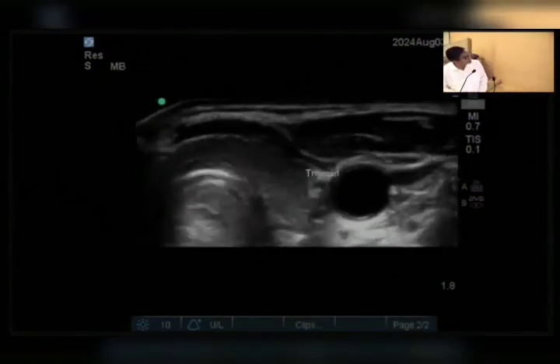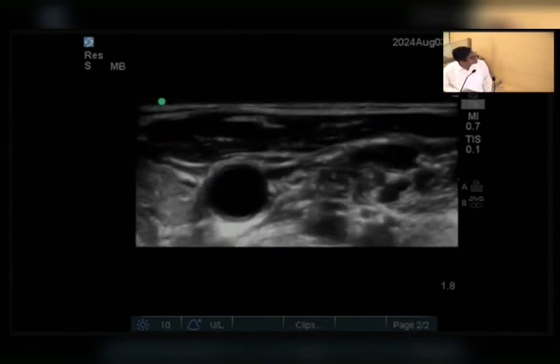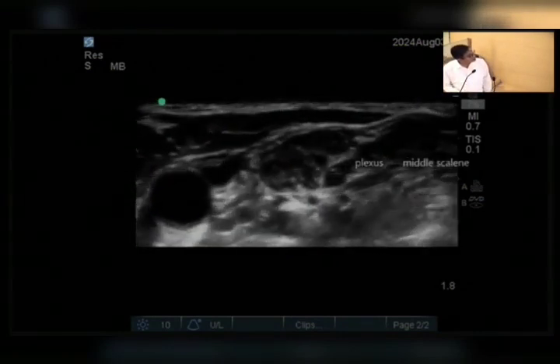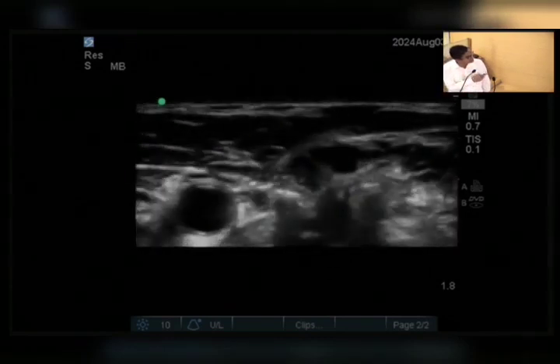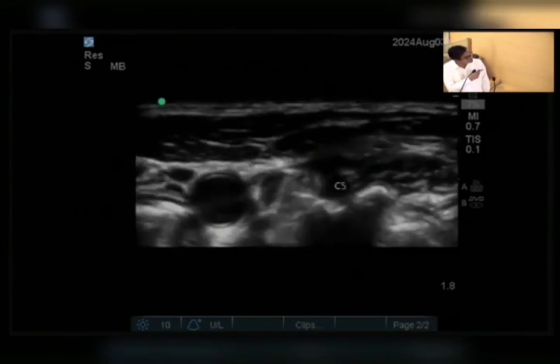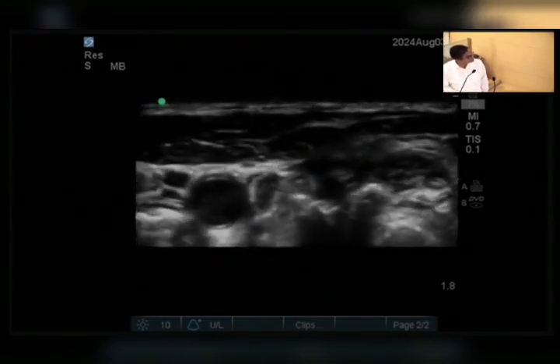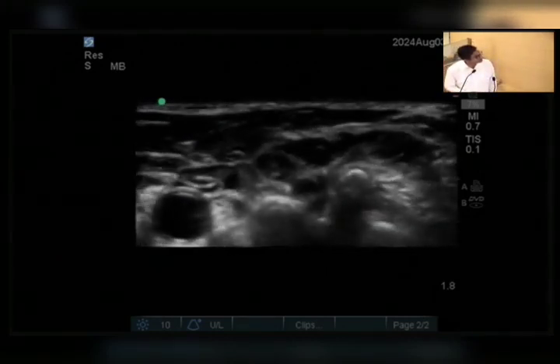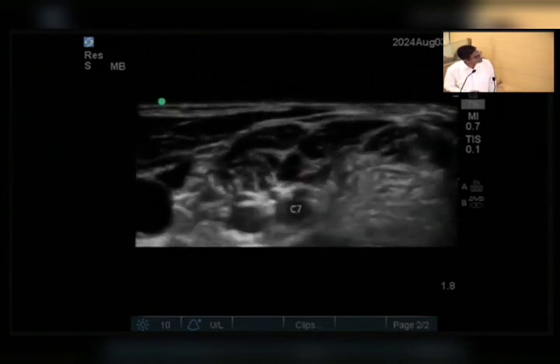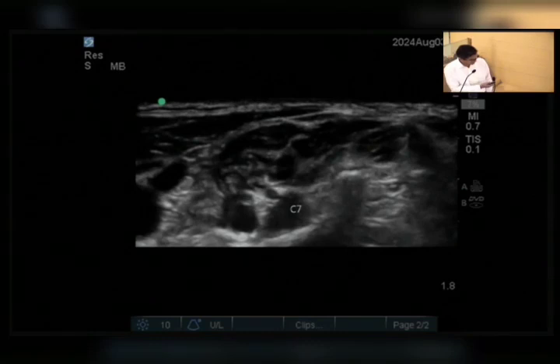So for the scanning technique, first you go from cricoid to the interscalene groove. See, the plexus is visible, with two scalene muscles in between. This is C7, vertebral vessels are seen. This is C6, two tubercles. Here C5, two tubercles. Let's go caudally: C5, this is C6, and this is C7. We find vertebral vessels over here because of the absence of the anterior tubercle. So this is the plane from where we will insert the needle, from lateral to medial, and reach these plexus.